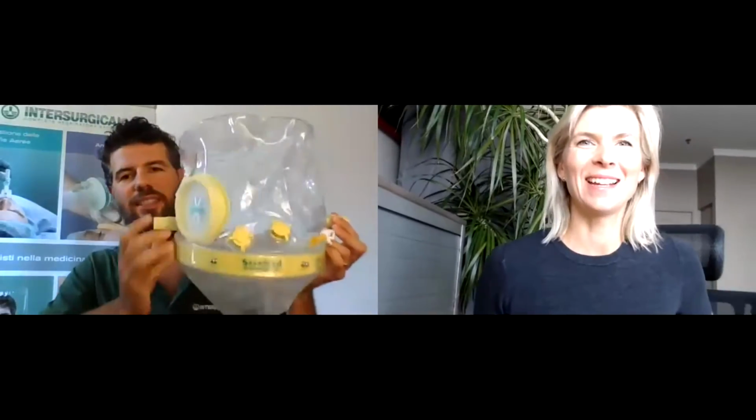So this helmet, you have it with you, right? Can you show it to us? Yes. And that's our hood, right? For NIV. Yes, that's the name of it. That's the StarMed Intersurgical NIV hood. Yeah, I can show you, hopefully without confusing anyone, this is a CPAP hood from StarMed, which is basically a bigger volume and with a CPAP feature, which is a manometer in here.